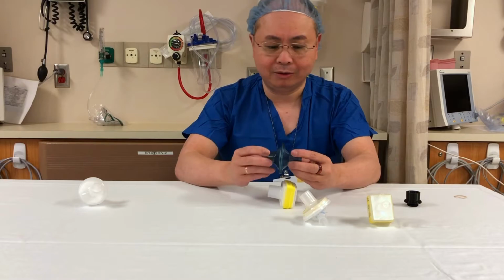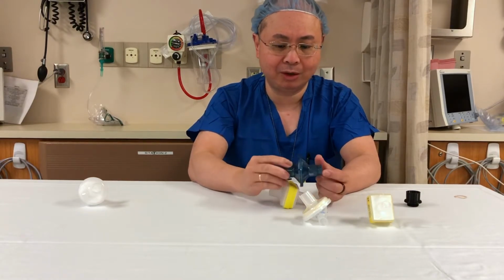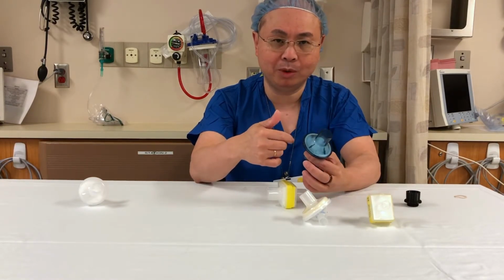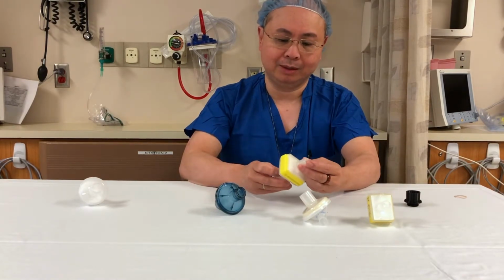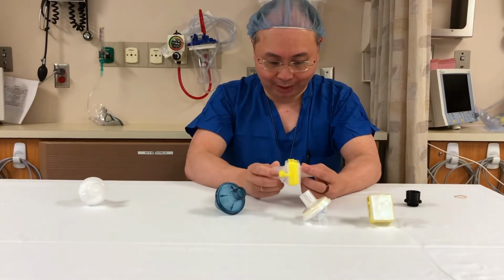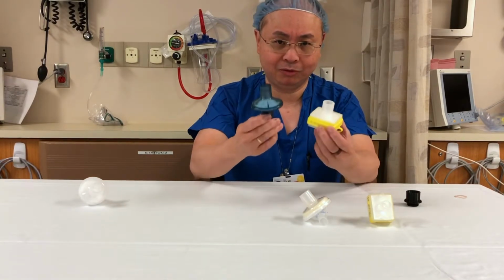You'll find that the filters which are purely filters have a much lower flow resistance. In fact, this ViroMax filter, when you test it at 60 liters per minute, only has a pressure drop of 1.5 centimeters H2O. In contrast, the HydroGuard Mini, which is also an HME, so it's an HMEF, has a flow resistance at that same rate of 2.9 centimeters, so nearly double the resistance to flow.